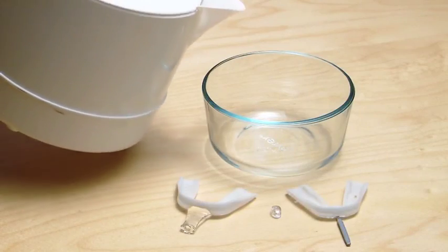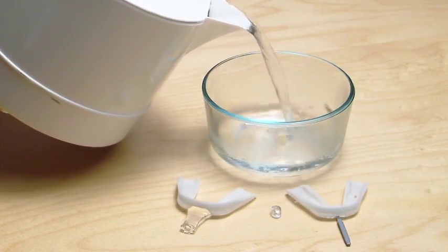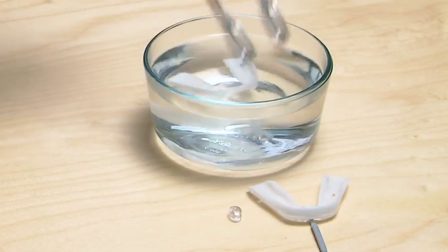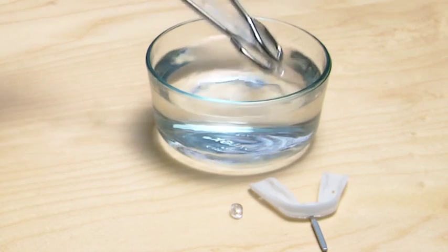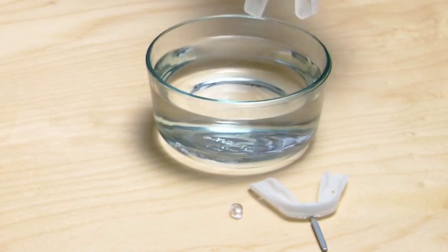Pour boiling water into a bowl. Submerge the upper tray in the water for 1 minute. Remove the tray with a pair of tongs. Shake off the excess water and wait for 20 seconds, allowing the tray to cool slightly.